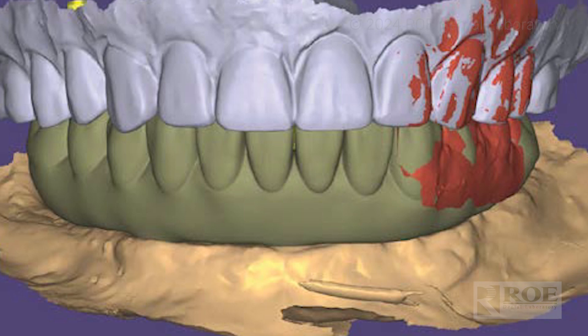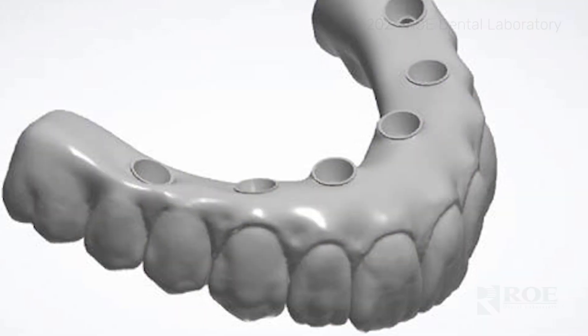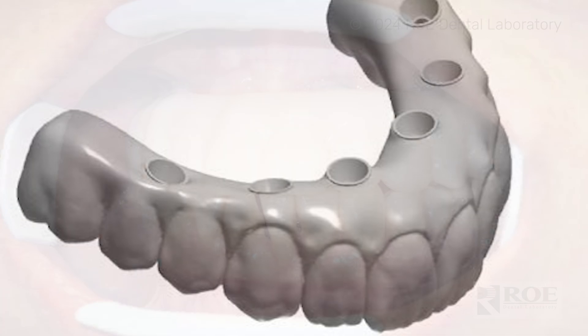That 360-degree scan is enough to give us those positions and the tissue itself. Depending on your intraoral scanner, you may have to do those steps in a particular way — it just depends on the workflow of the scanner itself. But in general, we need the photogrammetry records and a 360-degree scan of that reline denture.